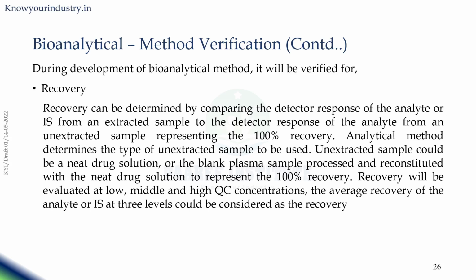Generally we try to achieve a very high recovery with the extraction method, and sometimes it is low, but it should be consistent. It should not vary. That is more important in the case of biological matrices.